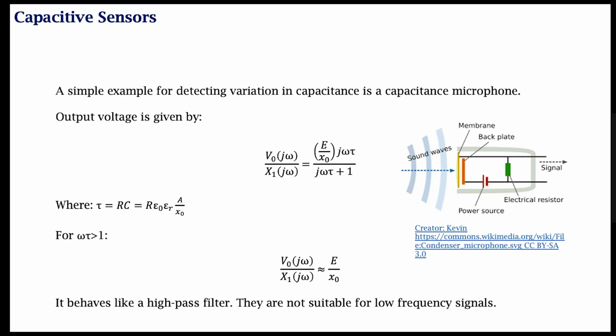There are actually digital stethoscopes available that not only provide the sound, they also have high sensitivity within the dynamic range, but they also send the heart sounds by Bluetooth to the doctor's phone, for example.